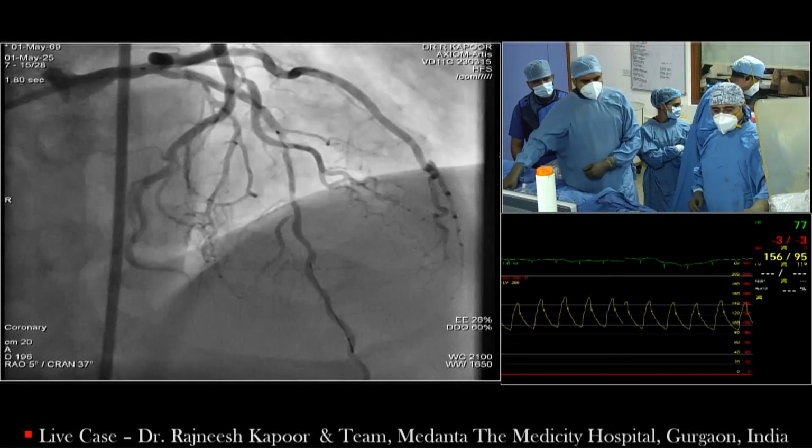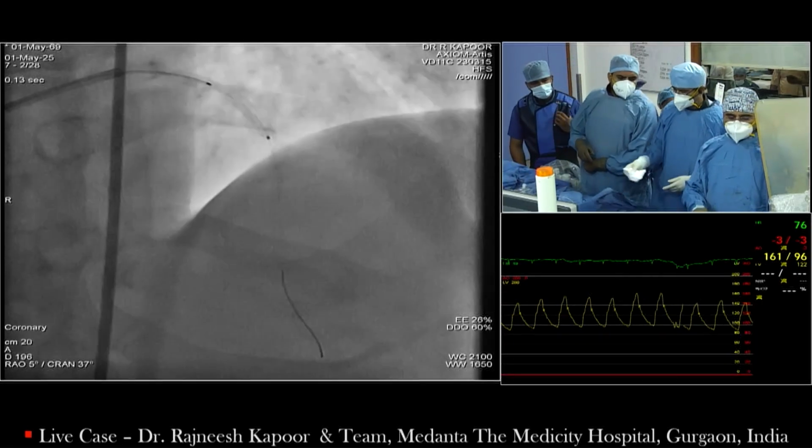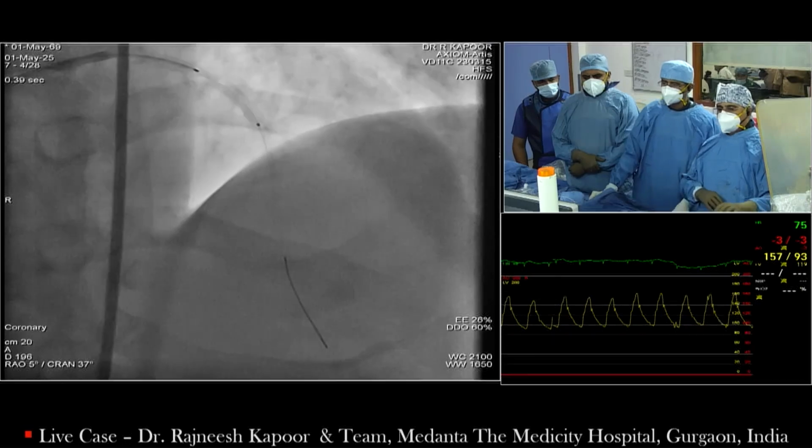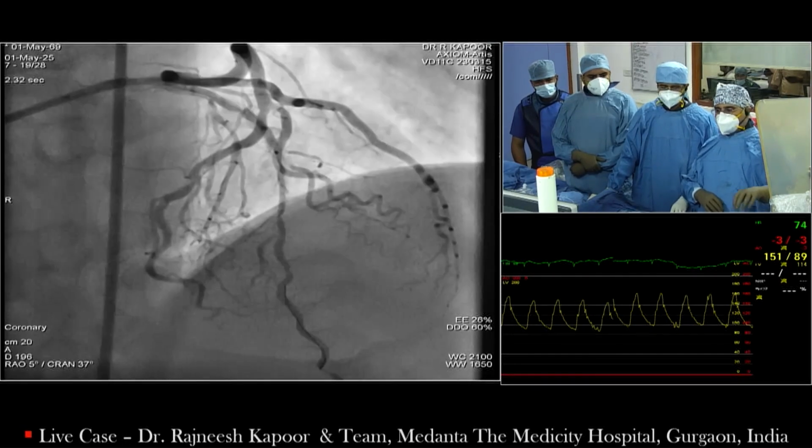Thank you. Right, right. So I think we have an agreement on the panel: rotational atherectomy directly, with a 1.5 device. Don, what do you think?